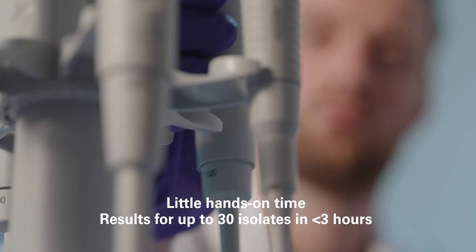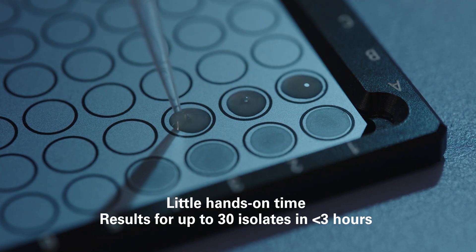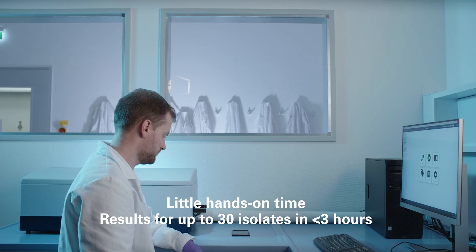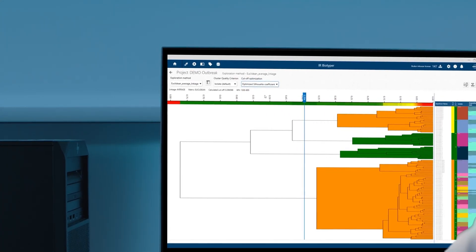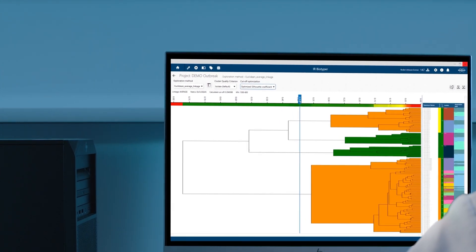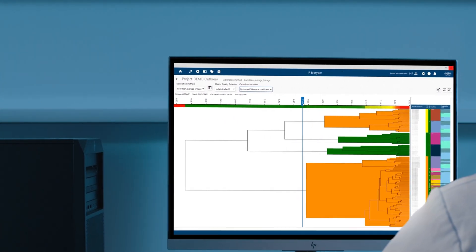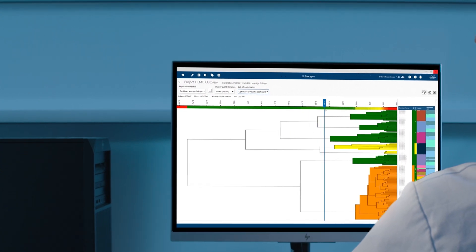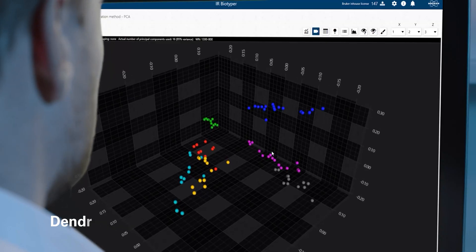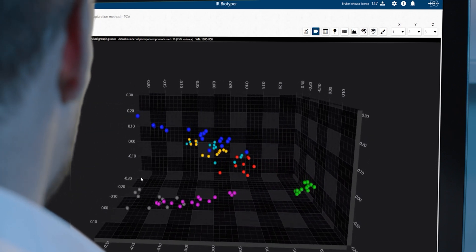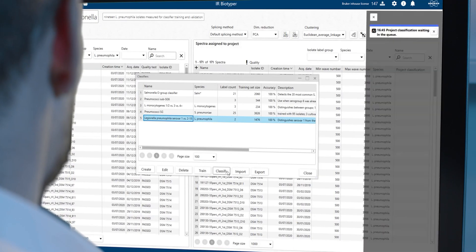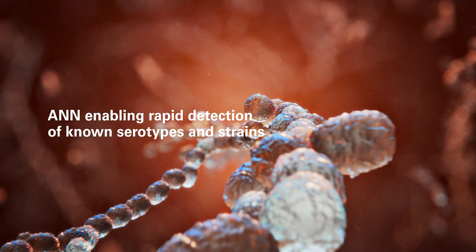After a straightforward sample preparation procedure that starts from a culture, the silicon plate is simply inserted into the IR Biotyper and the analysis begins. Isolate clustering, equivalent to molecular methods, is visualized through convenient tools such as dendrograms, distance matrices, and scatter plots. Pre-defined classification models based on artificial neural networks enable the rapid detection of known serotypes and strains.